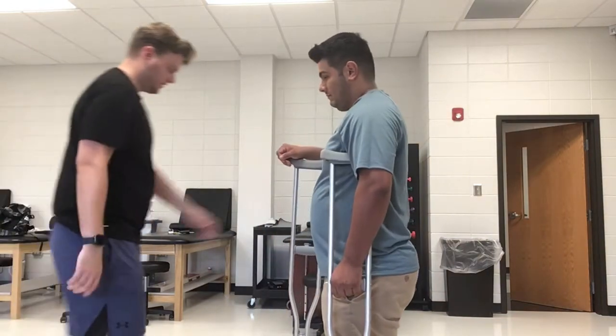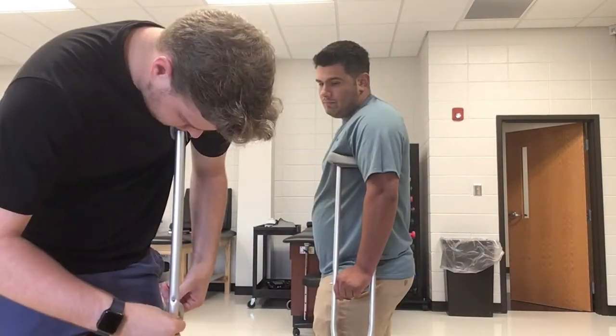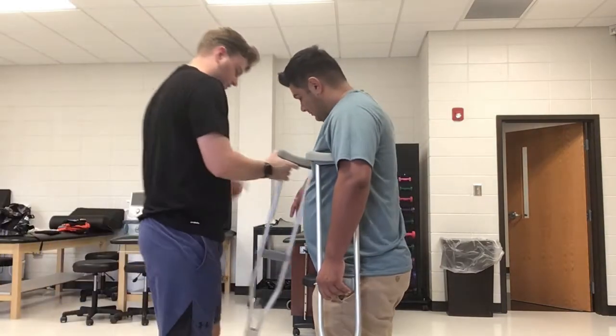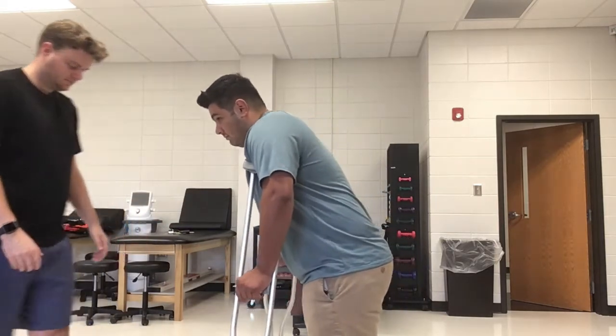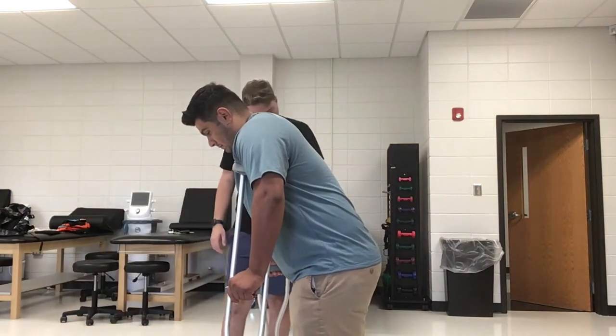Alright, and I think we're good with that one, so I'm gonna just adjust this one to the same thing. Alright, so here's that one, and the same thing for both of them, 6 inches out to the side, and 6 inches forward. Alright, well, now that we've got you fitted, we've gotta teach you how to walk on them.